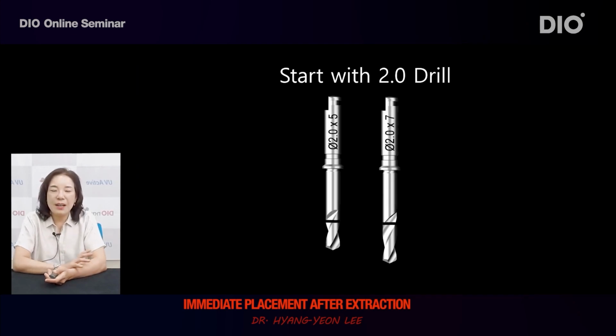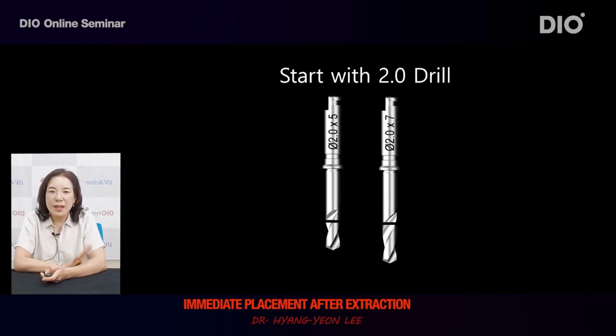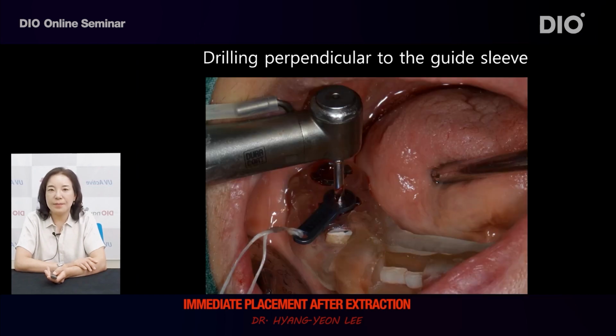If the tooth extraction socket cavity is not that deep, start with a 2.0 by 5 drill. If the tooth extraction socket cavity is too deep because it is too large, a 2.0 by 7 drill can be used. A 2.0 by 8.5 drill can be used first depending on the situation. Insert the drill tube into the guide sleeve and start with the 2.0 drill. At this time, you must take precaution to ensure that the 2.0 drill enters the drill tube vertically.